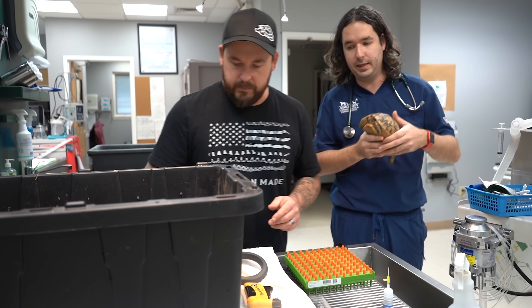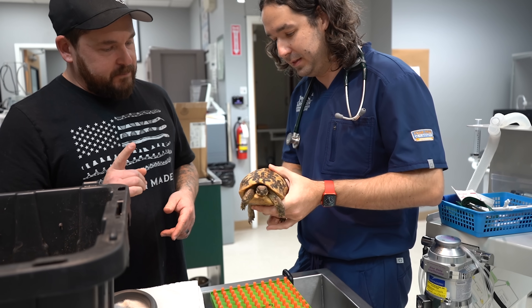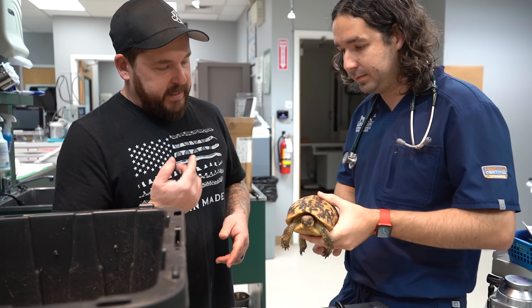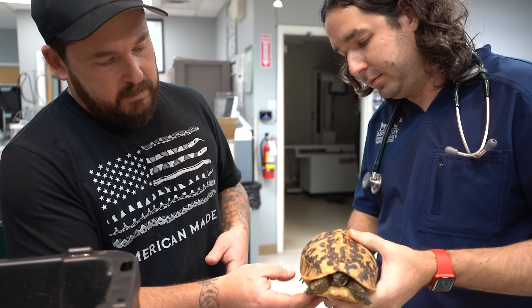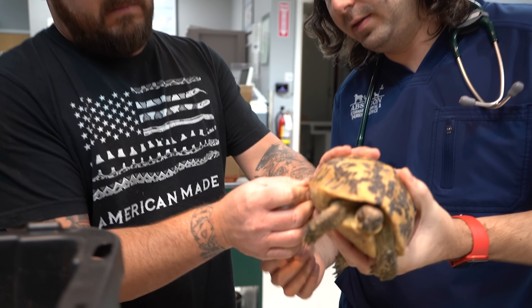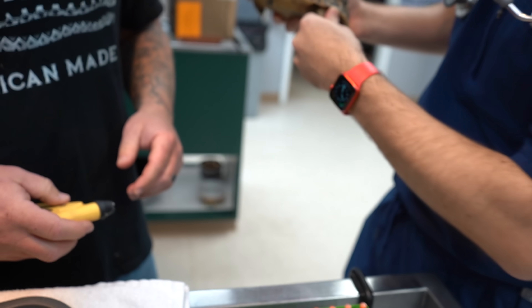We can microchip the tortoise today and take it home again. We gotta go in basically what's considered the thigh. We're gonna pull the leg out — can you assist with this? Come on out, just for demonstration.